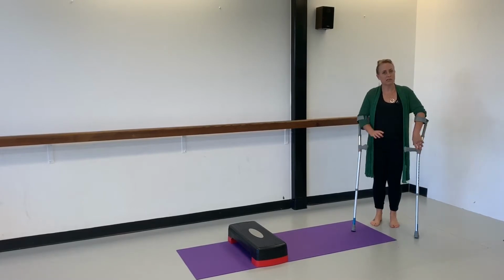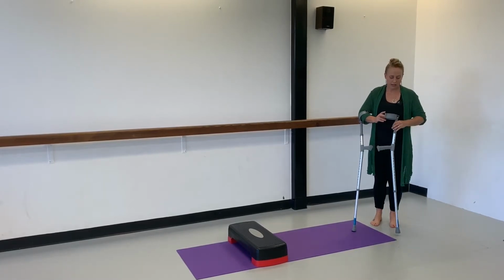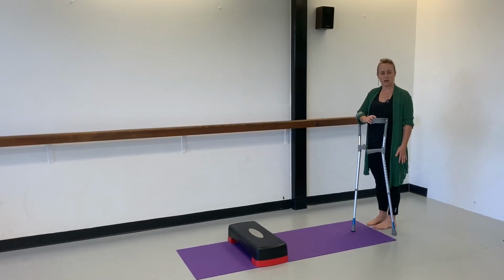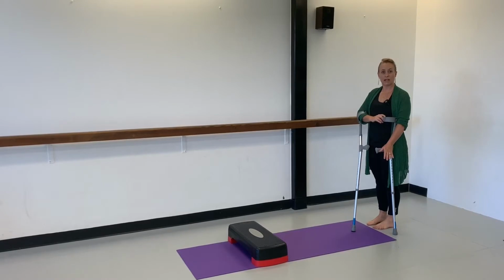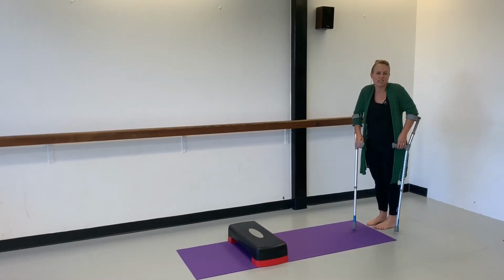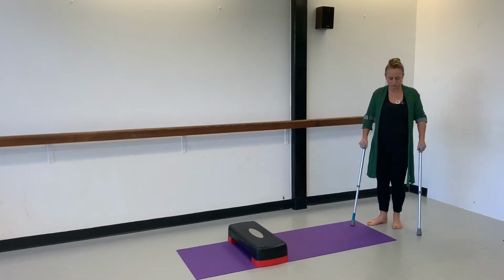Now your physiotherapist in hospital should have given you some crutches. They are normally at the height of your wrist crease, so if you have your hands by your side, the handle should be roughly at your wrist crease. So that's to know that they're at the right height for you. Otherwise they become too high and you get neck pain.